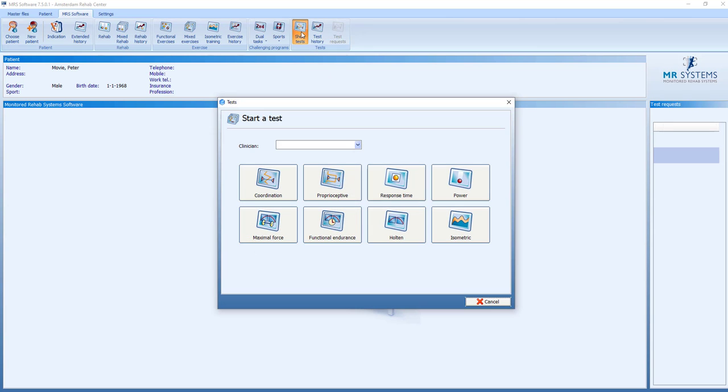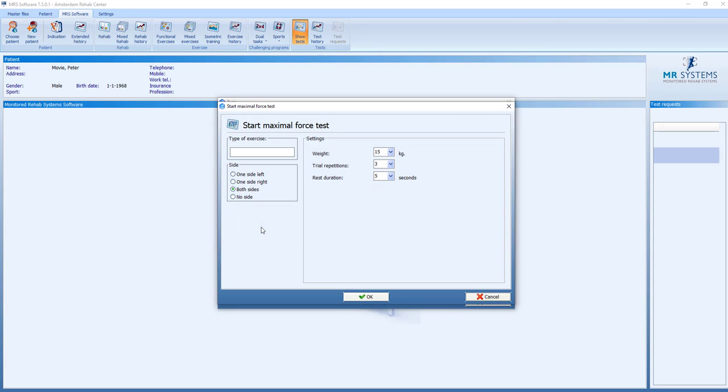We will now have a look at the Maximal Force Test, also known as the One Repetition Maximum. We can select to do this test at one side or both sides.